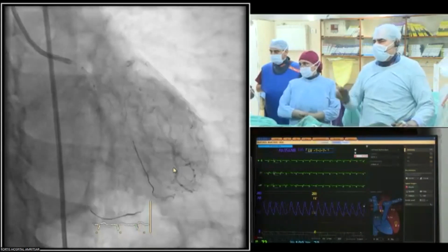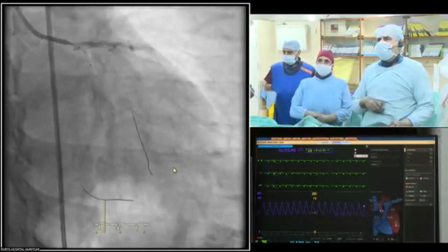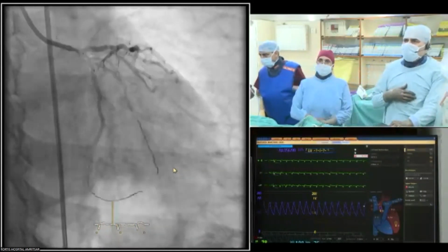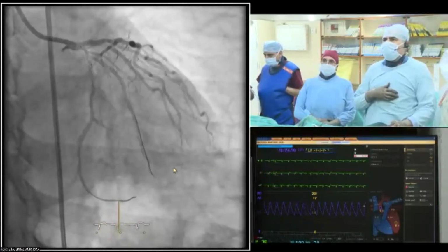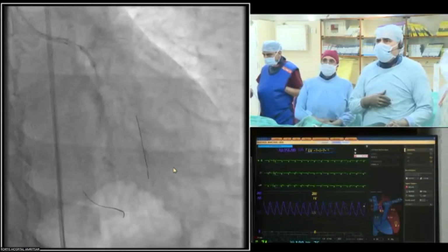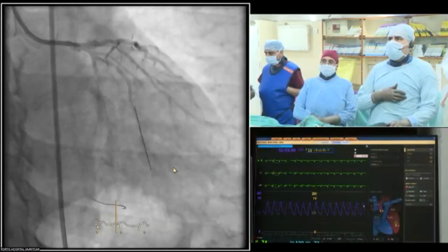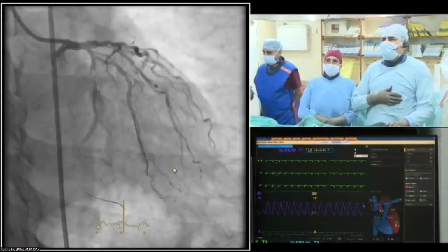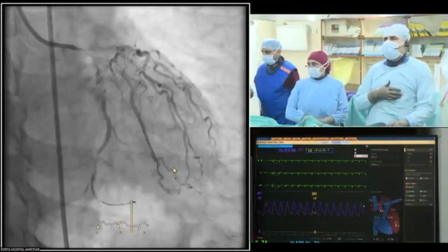So, as planned, we started with a cutting balloon. The vessel was 2.75 distally and 3 millimeter at the ostium. So we took a 2.75 Wolverine cutting balloon next, and went up to 10 atmospheres because there was a small edge persisting. But after that, we got this. So option number one. Then I didn't have much choice, so we changed the plan to a stent.